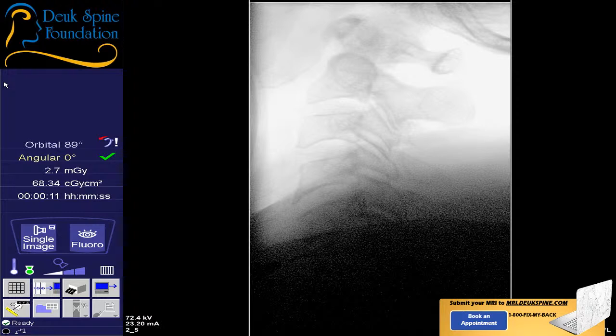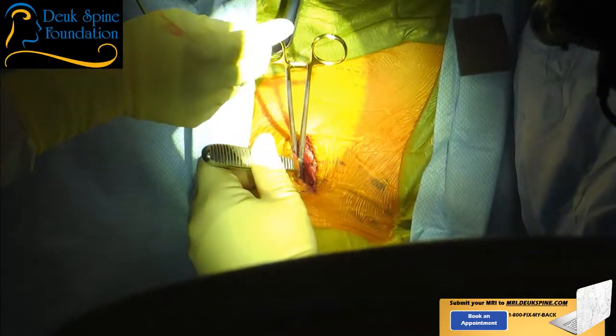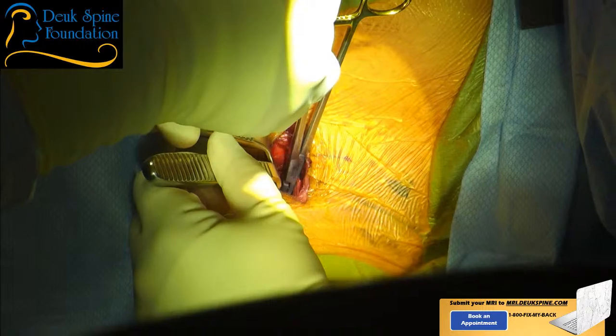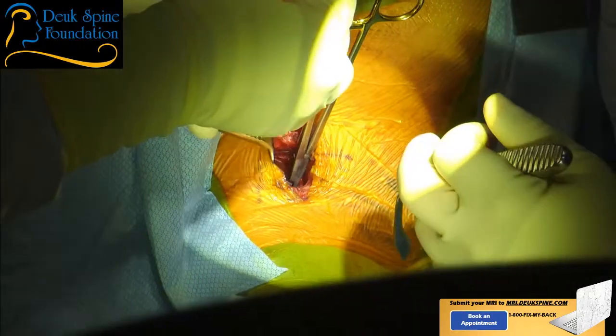And if you're wondering, we have literally the top of the line in the world fluoroscope here. So there is no better. And if we didn't have this fluoroscope, I honestly don't think we could do this surgery. Hold this here. I got to get my hand around here. There you go. Don't come out, whatever you do. You can see all the anatomy. Take this. Oh, actually, I need this. Take this, Dr. Patel.